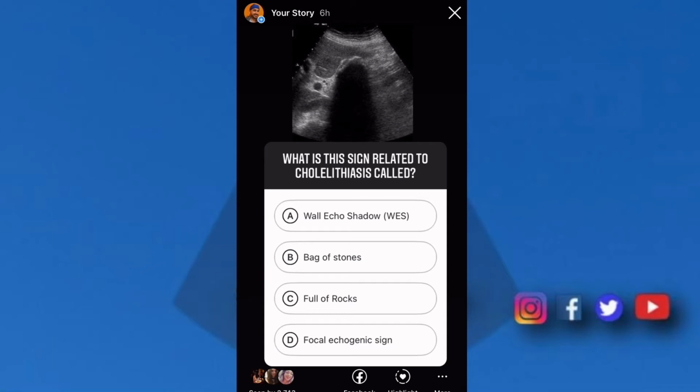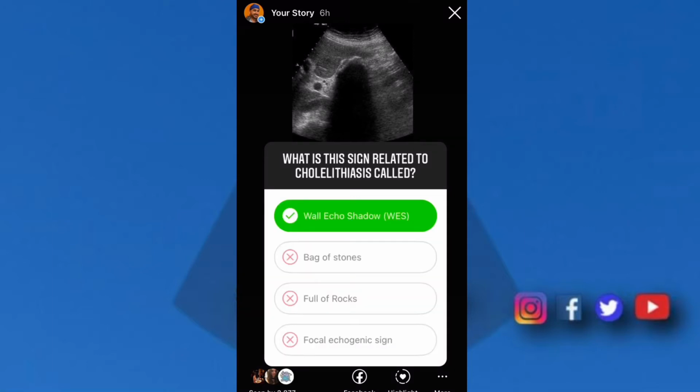What is this sign related to cholelithiasis called? And the answer is A, wall echo shadow sign. Nothing else. The sign refers to a gallbladder filled with stones, so with the ultrasound you get an interface of the wall of the gallbladder, the echo of the stones, and a large shadow.